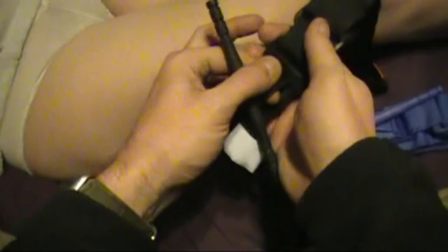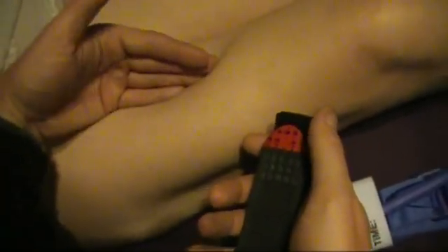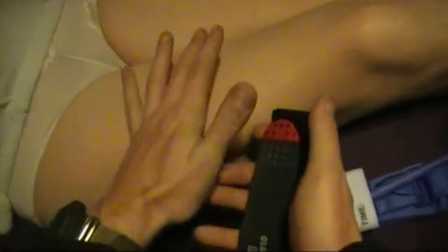You've got a Velcro band, a little buckle here, and inside this wider band is a thinner nylon band that's allowed to freely slip into it. So when you tension up the strap, it constricts down tight. You actually want a tourniquet that is reasonably wide, for two reasons. One, it does less damage to your patient, and it also allows for the fact that you're really not pressing the tourniquet directly against the arterial bleed. The femoral artery, like most of your arteries, is right next to the bone, so you're actually pressing on all the musculature to clench around it and stop the bleeding.